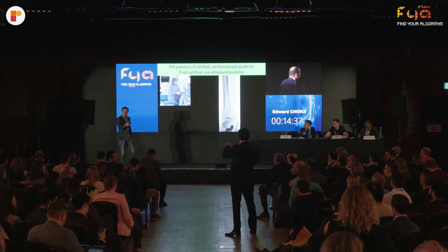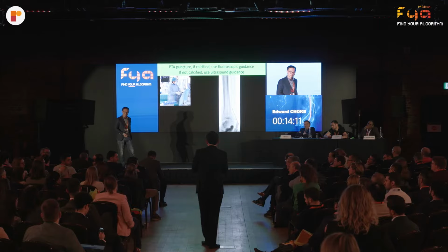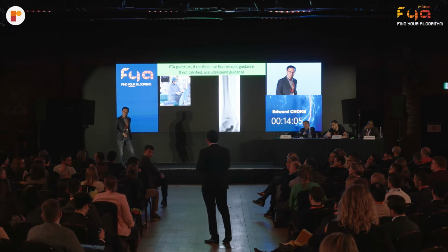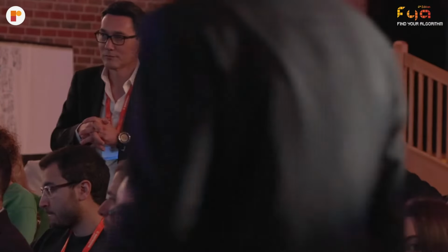I see, August, you were about to say something. You published a great technique on how to deal with that very mobile, calcified artery. Yes. It's really, really difficult to puncture because whenever you try to puncture it, it just refuses to be punctured. And probably Marta has the answer. Well, you can use 2 needles using the buddy needle technique published by our group. You can even use 3 needles in a chopstick manner in order to keep the artery without movement. So you use one needle and you puncture with another one. This is really useful. Great technique. So I encourage you guys, if you haven't read the paper, go and get the paper.